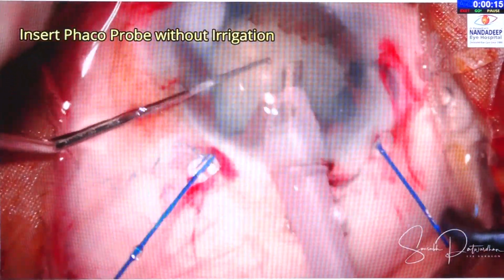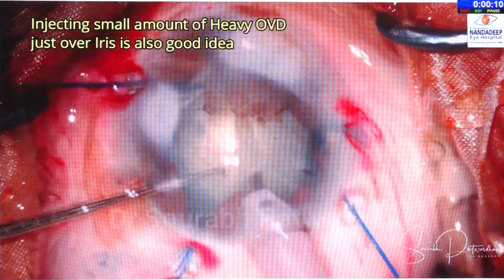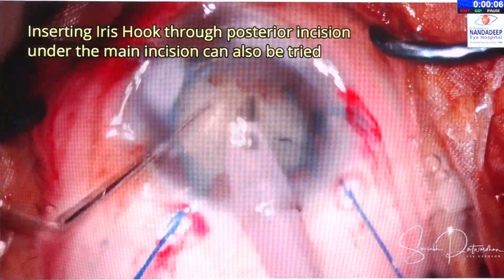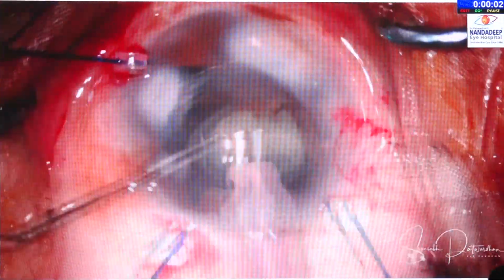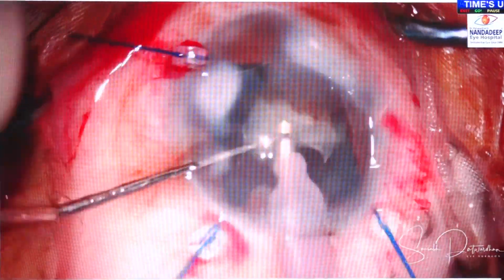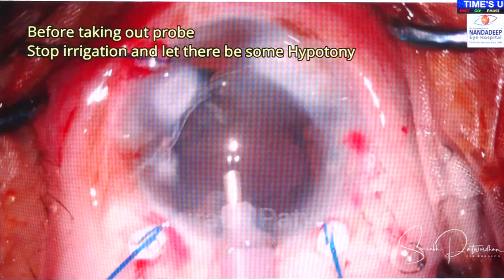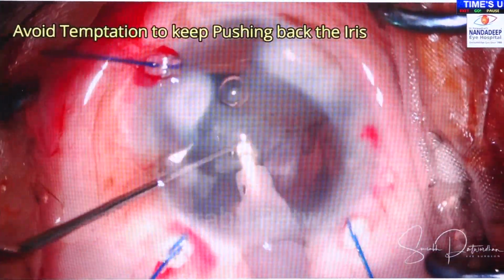Now, one thing is that always put the phaco probe inside the AC without irrigation on. If you keep the irrigation on and enter the AC where there is already iris prolapsing, the irrigation enters the AC first and then it causes more iris prolapse. So follow this ritual: put the irrigation off, go in, and before taking out, make sure you stop the irrigation, let there be a little bit of hypotonia and then come out.